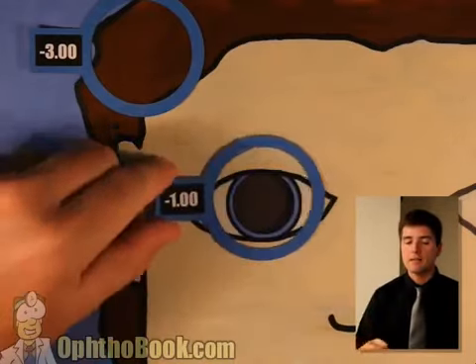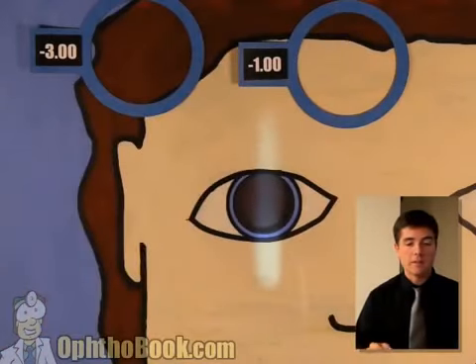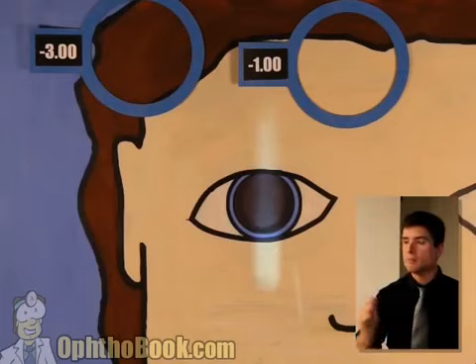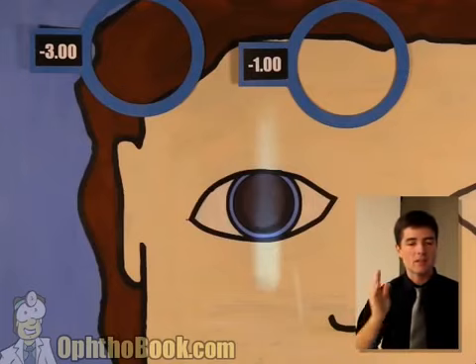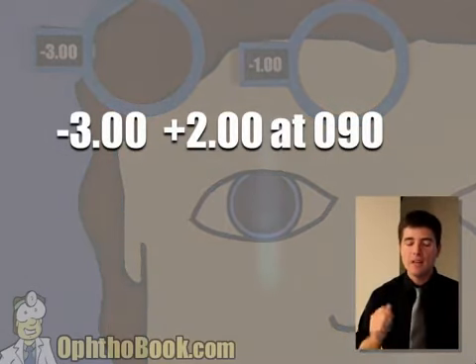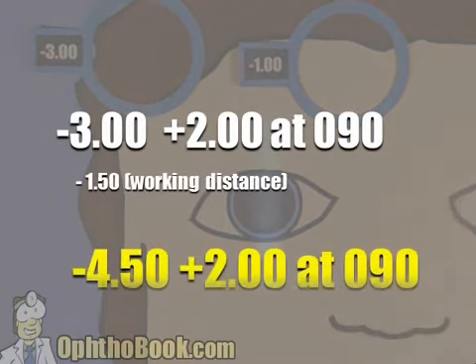So put these lenses aside. If you don't put them aside, you'll get confused. Now you can write it down. This is a -3. The difference is a +2, and the axis is at 90. You write this down, -3 +2 at 90. Then you do the math. Subtract your working distance, and the final answer is a -4.50 +2 at 90.